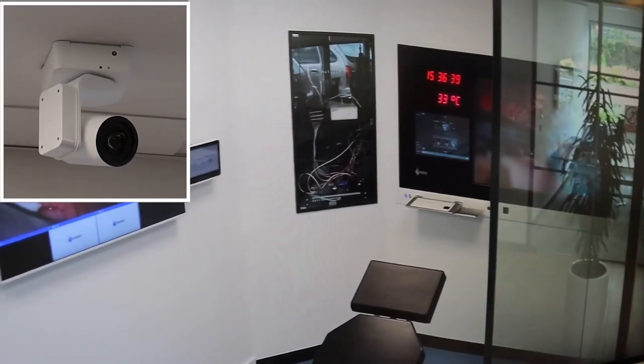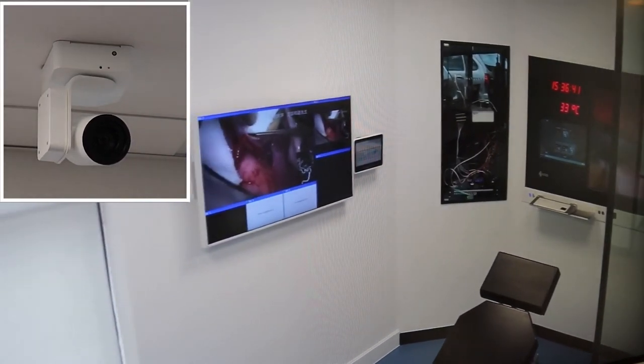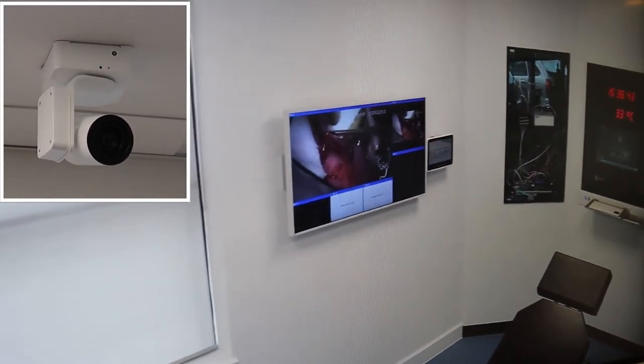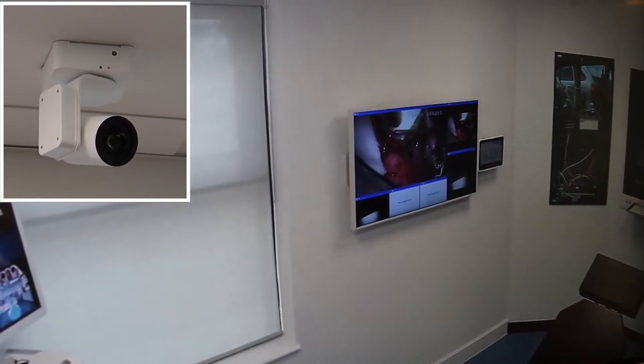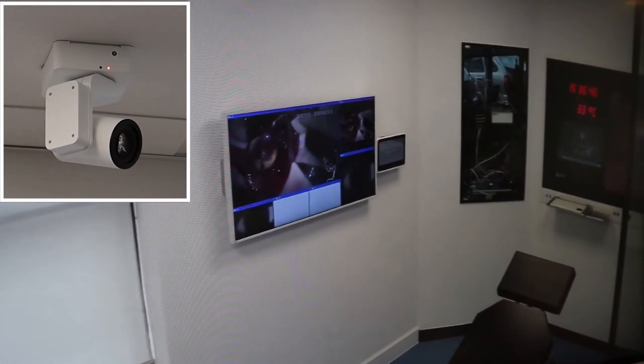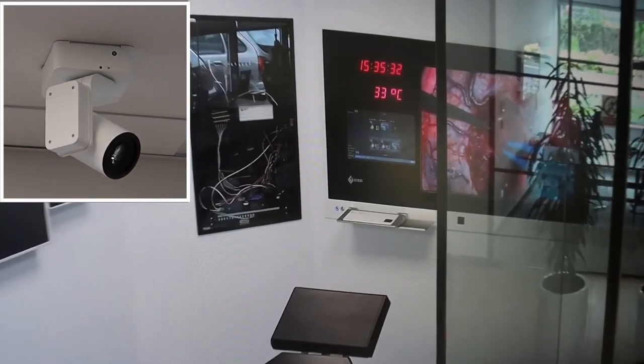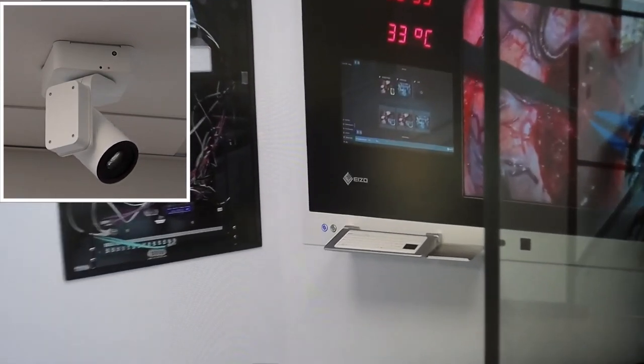This is our Creator PTRZ surgical view camera. With 4K resolution, 30 times optical zoom and integrated tri-axle camera mount, this allows for high definition and intuitive capture of surgical proceedings.